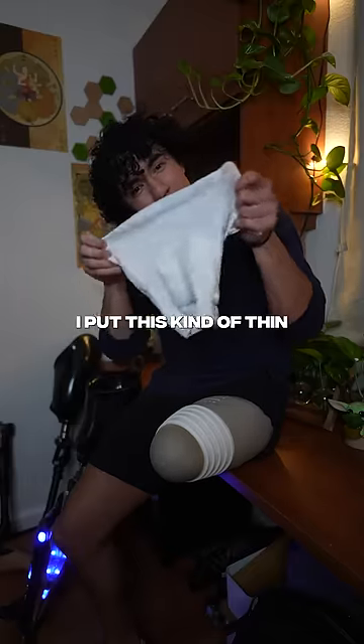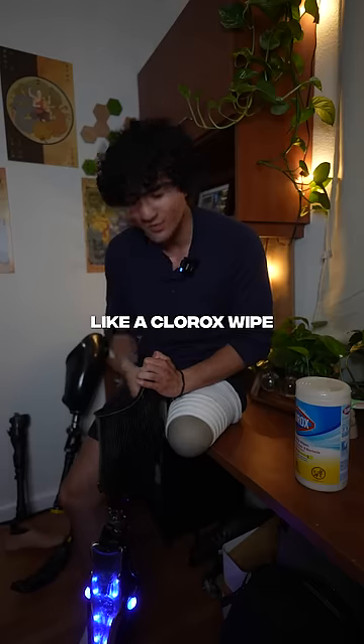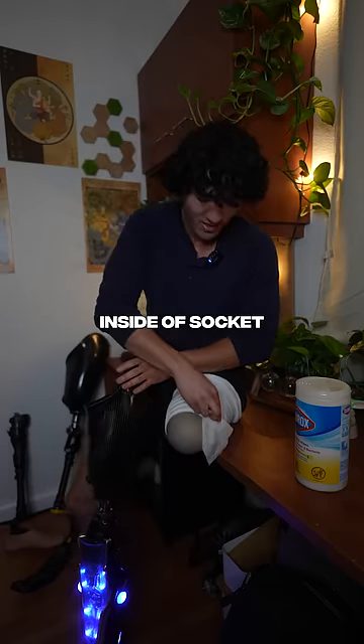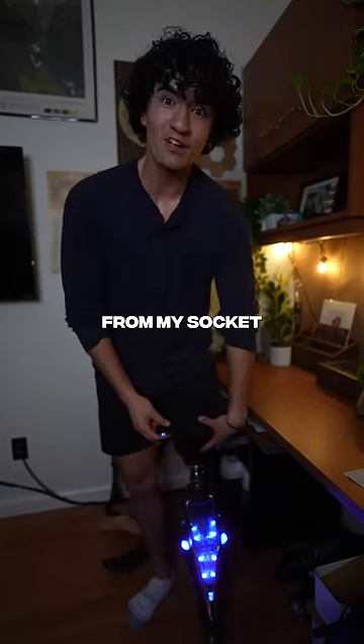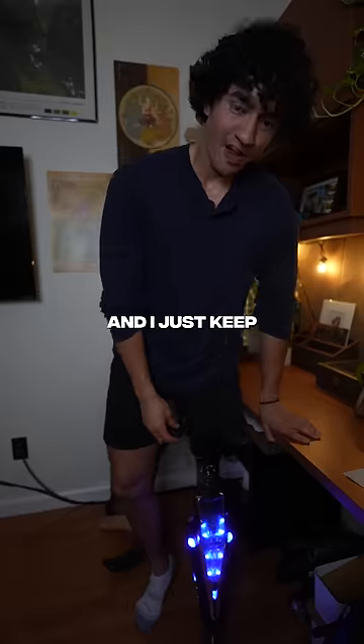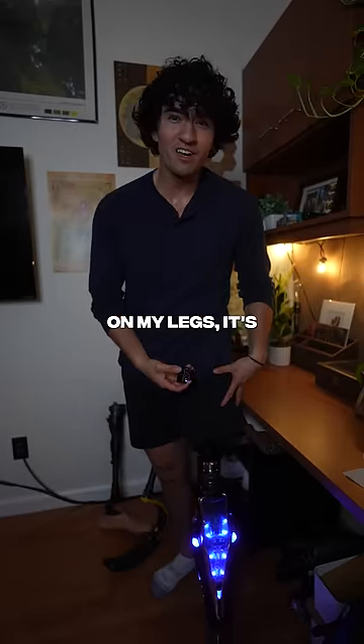All I do is put this kind of thin, two-ply fabric sock on. I have to grab a Clorox wipe or some rubbing alcohol to put inside the socket and a little bit on the liner, then pop my leg on. What you're gonna hear is the air from my socket releasing from this little valve here, and I just keep pressing up and down until you don't hear the air. If I don't have the sock on, my leg is just gonna pop off.